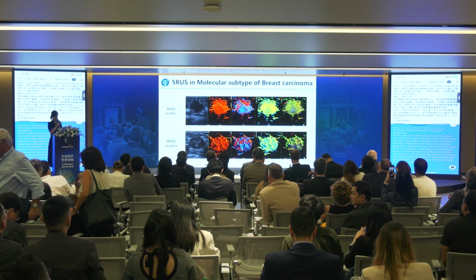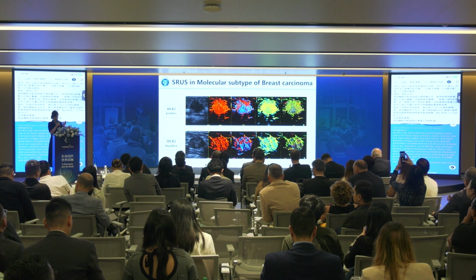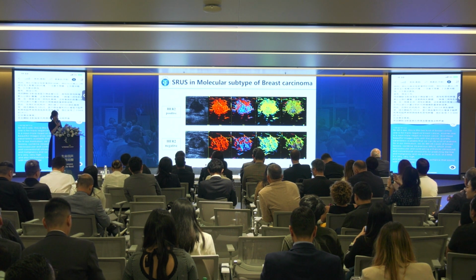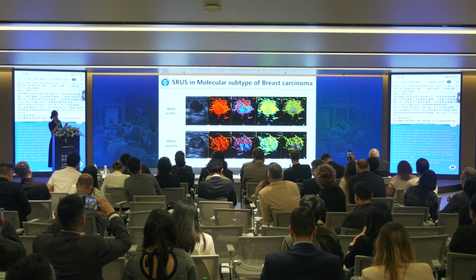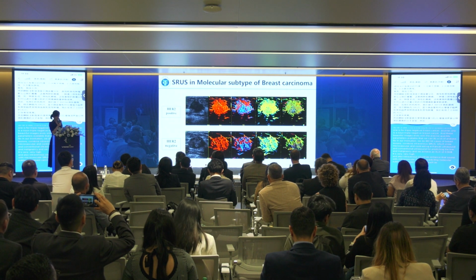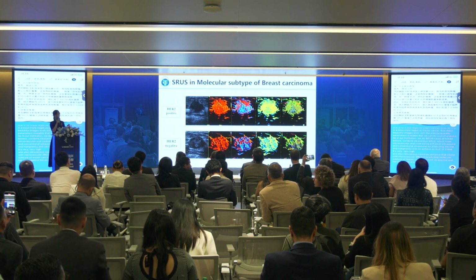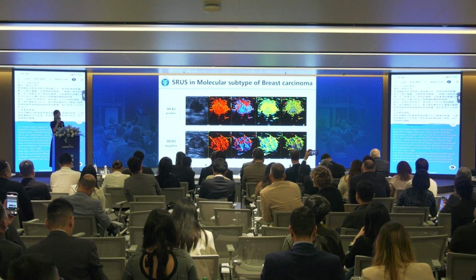And also, intravenous contrast-enhanced ultrasound with microvascular SRUS in predicting molecular subtype of breast carcinoma, such as HER2 positive and HER2 negative, because these 2 kinds of breast cancer have different prognosis.